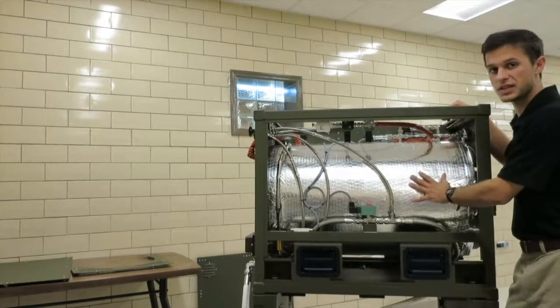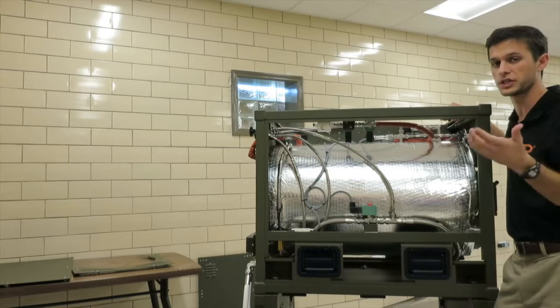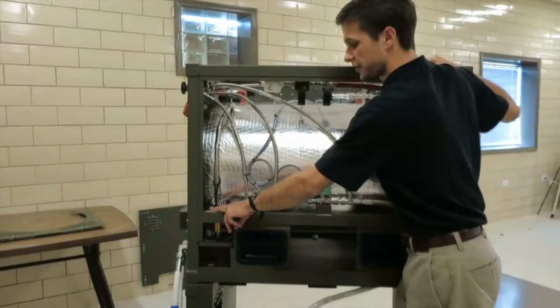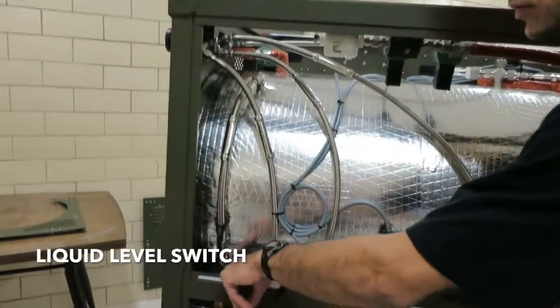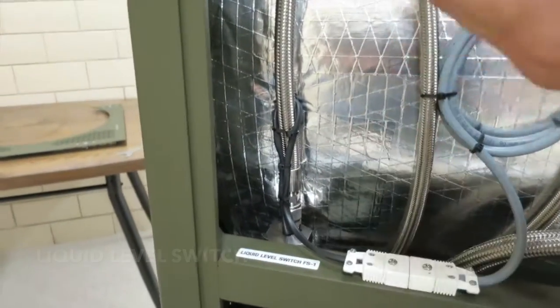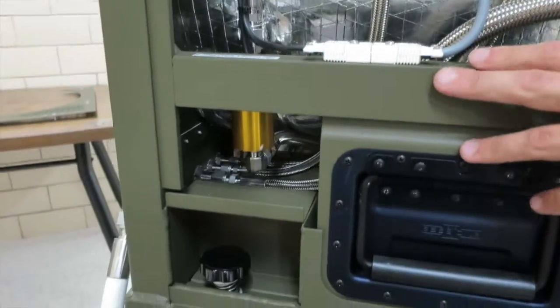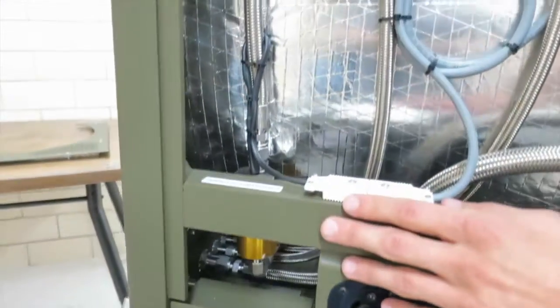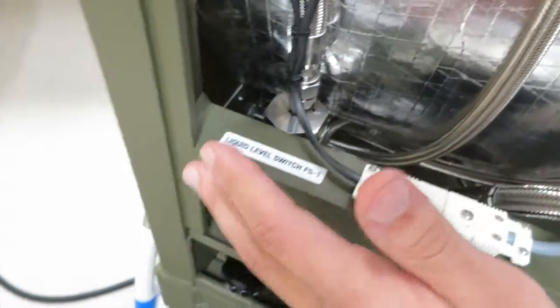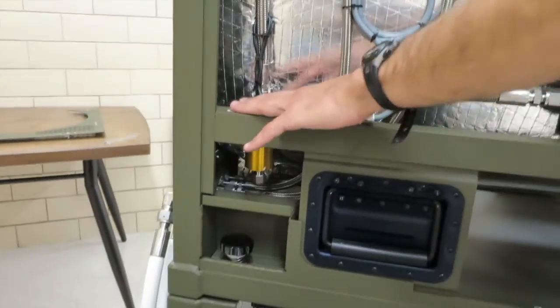So right now we're on the left side panel of the sterilizer. You can follow along in the technical manual in section 4, towards the back. Starting in the bottom left, we have the liquid level switch. It has a little float that is activated when you fill the jacket up with water. This switch tells the PLC whether there's water or not. If there's water, the PLC will operate as normal and turn on the heaters. If the jacket gets empty of water, it will not turn the heaters on. So this protects you from overheating.